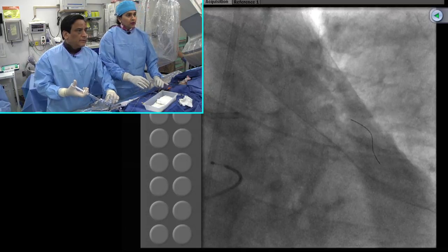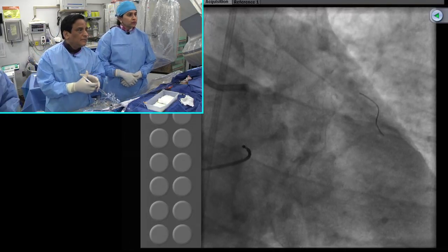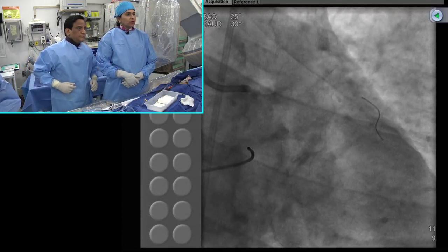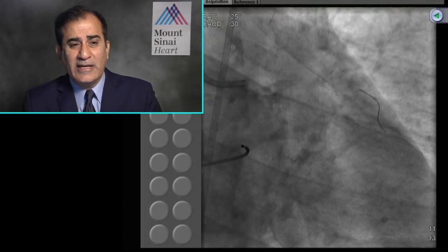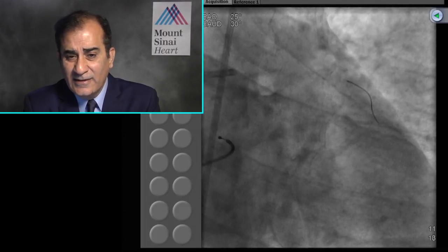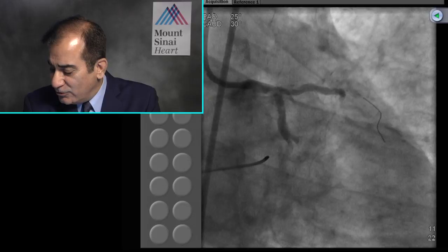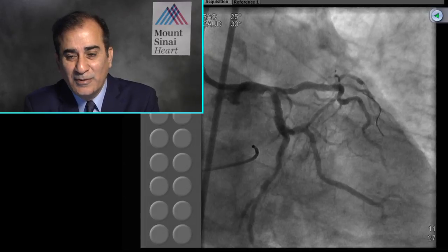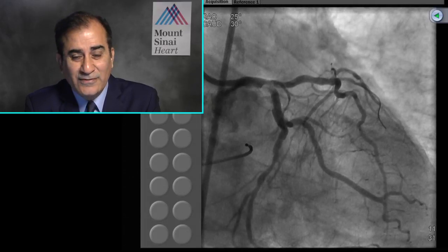Leave it there in case you want. Samin, you mentioned the Igaki Tamai stent being the first BVS platform, looking good, although more circ compromised, plaque shifting a little bit maybe. I don't think we should put another burr. Remember, all sorts of physicians will make claims about who was the first to talk about BVS. I remember I was training a site with laser angioplasty in 1992, and Marvin Slapian in Phoenix, Arizona, I heard him talk about bioresorbable stents. Yep. Each time I meet him, I tell him I don't know where he's working now, but that he was one of the first people I heard.